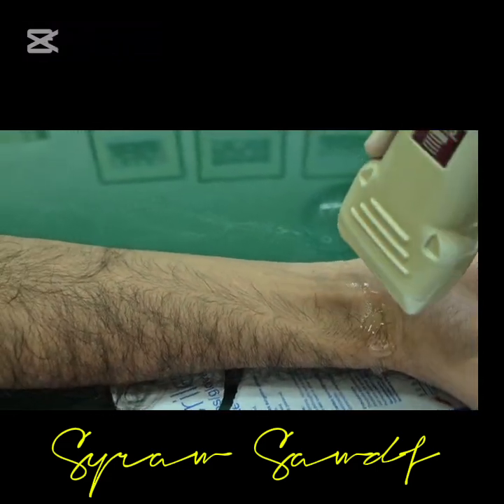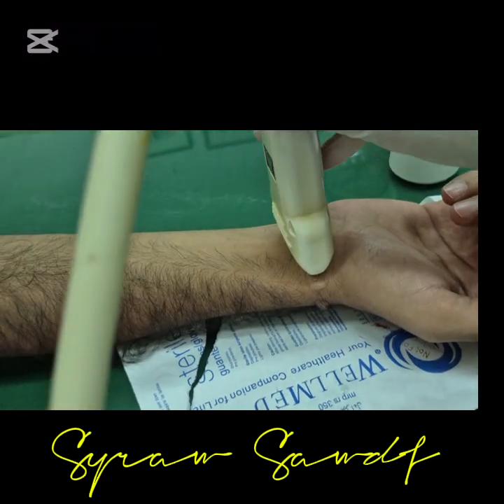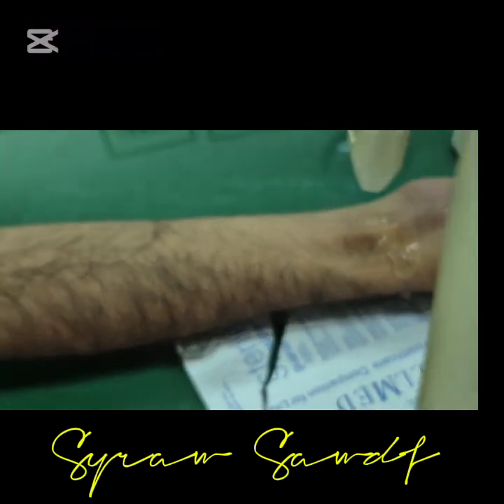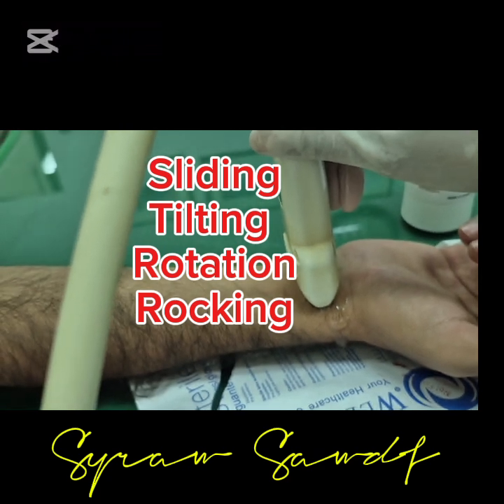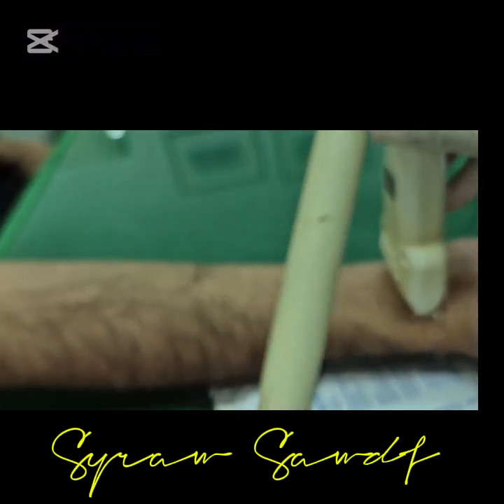So now I'm going to place my probe transversely over the forearm or the wrist, you can say. Now let me show you what is sliding, what is tilting, what is rotation, and what is rocking, right?